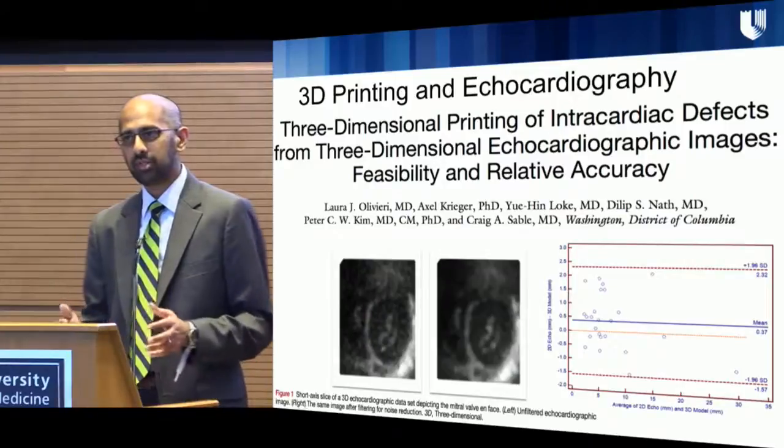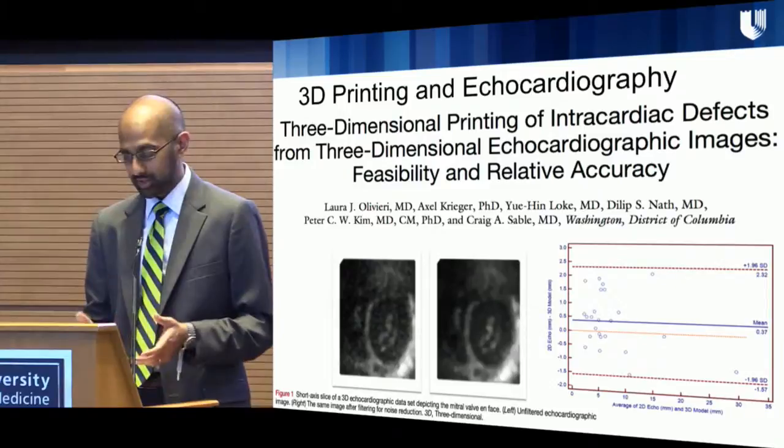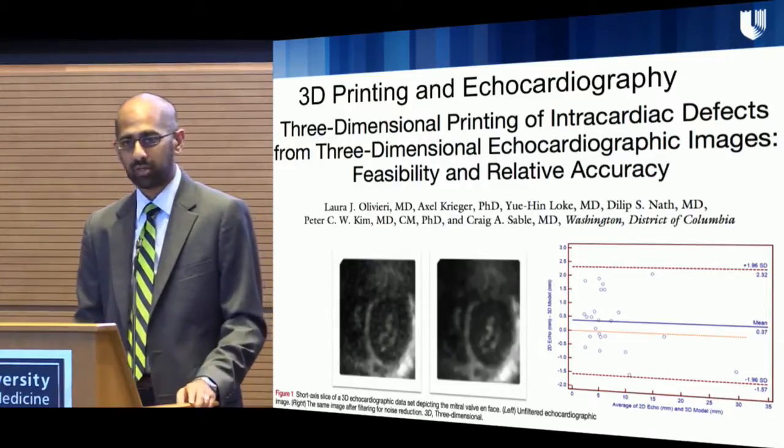And again, everything you've seen so far has been based on tomographic imaging, CT and MRI, but there is data out there now looking at using 3D echo to do these prints as well, although it is more difficult at this time.